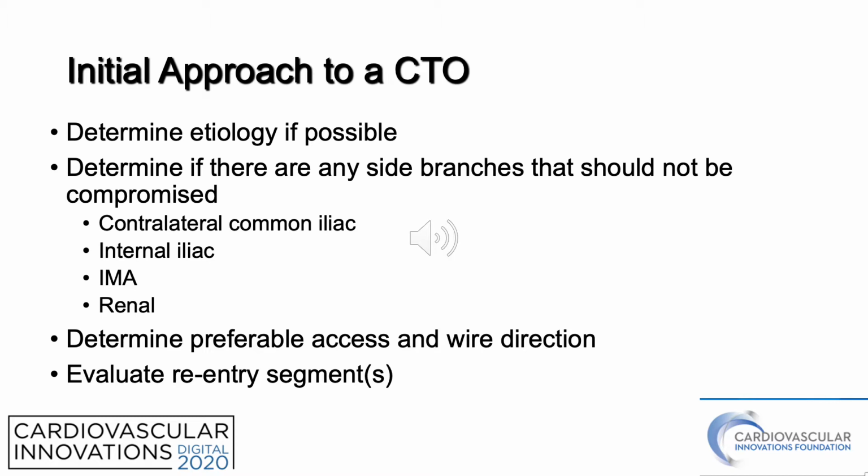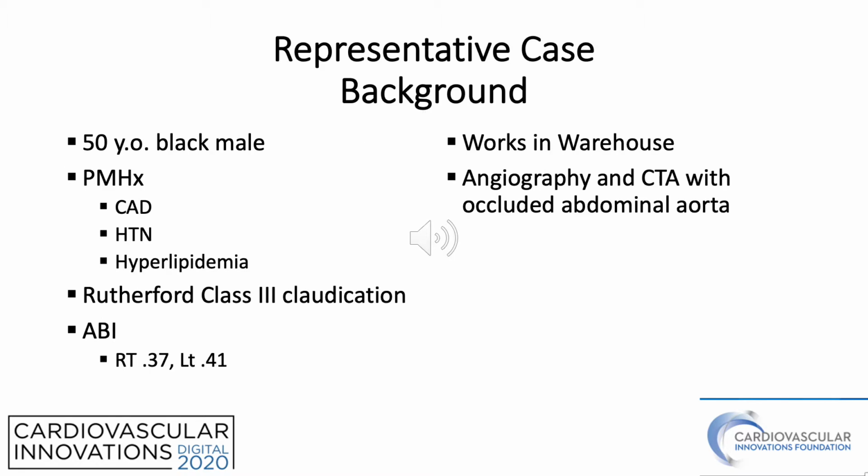Next, determine the preferable access sites and wire directions. And finally, evaluate the reentry segments. Let's start with a representative case.